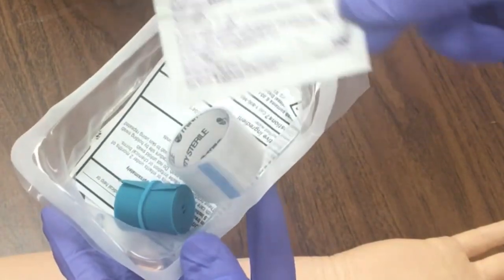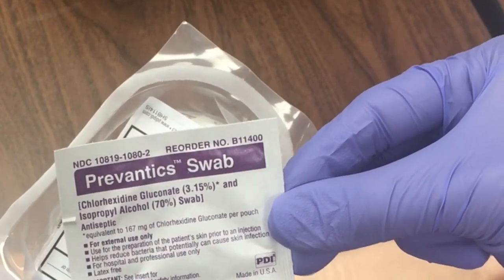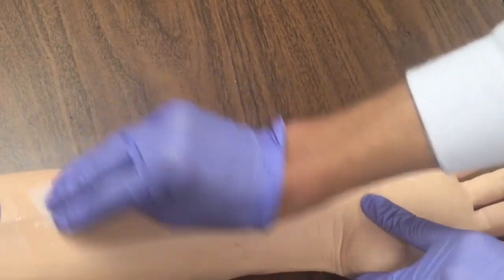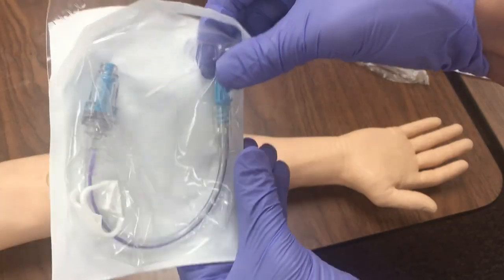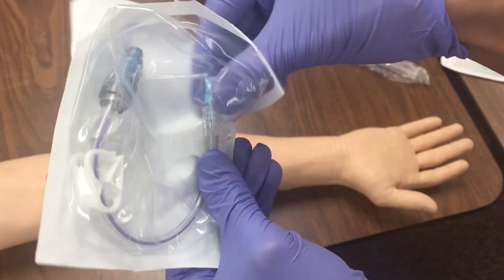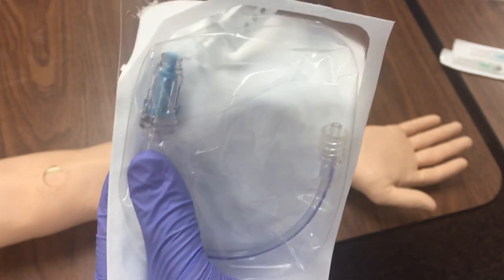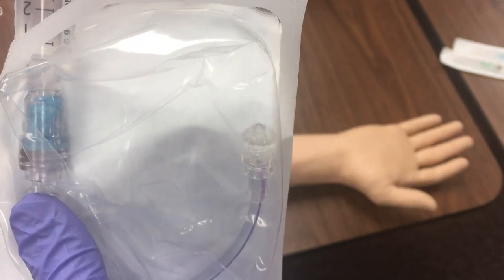The first thing you want to do is clean the skin area off with your chlorhexidine swab. You're supposed to rub vigorously for about 30 seconds or so, and then let it dry for about 2 minutes. It does take literally 2 minutes to dry. While it's drying, you can prepare the other items. Here we have the extension tubing. This particular one comes with a cap at the end, so I'm going to take the cap off. Then I'm going to prime the tubing by taking a flush and pushing the water through until it comes out the other side.